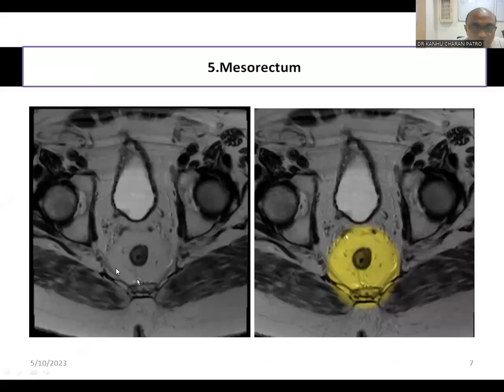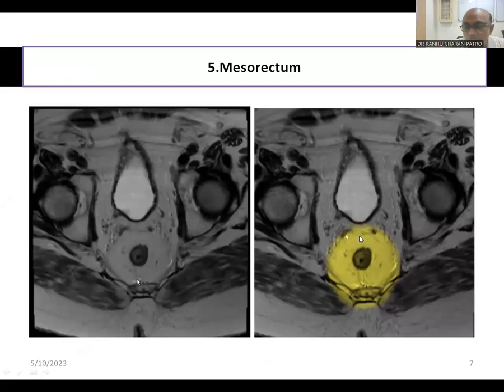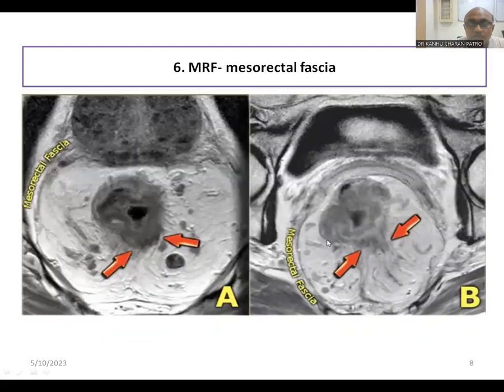You can see the mesorectum here. This is the rectum; the bright fatty tissue around the rectum is the mesorectum, surrounded by a small thin black area — this is called the mesorectal fascia. The yellow structure is the mesorectum, and this line is the mesorectal fascia. This is the rectum, the fatty structure is the mesorectum, and the black outline is the mesorectal fascia.